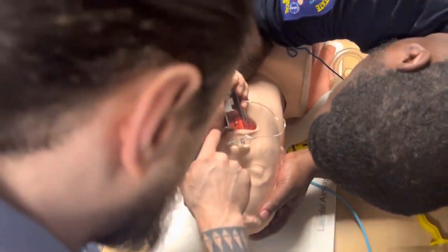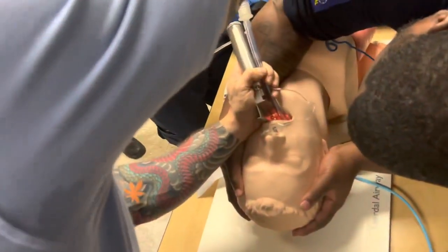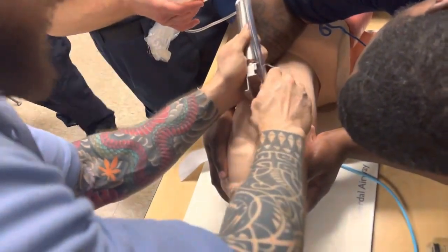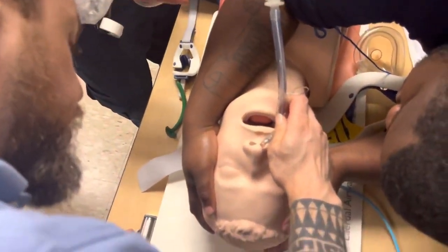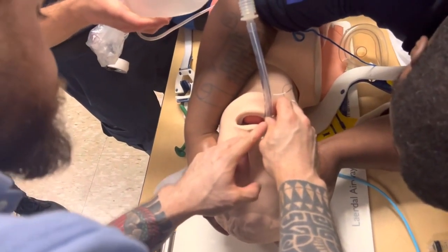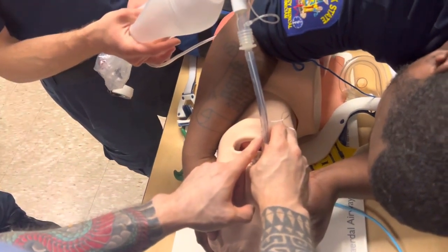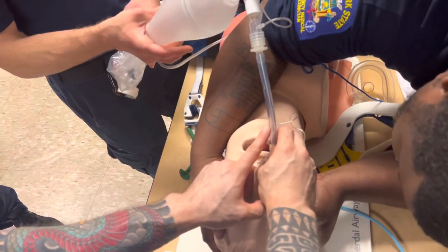Right? So the reason why I keep my blade in is I want to make sure, when I pulled out the bougie, I did not pull out the tube with it, right? So I see it's in, right? What I do is I hold it. I'm going to note it's marked, right? So this should be 3 times the diameter. This is a little too shallow for this person, right? This was 8.5, right? So I would want it to go deeper, right? So maybe 22 at the lip line, right?